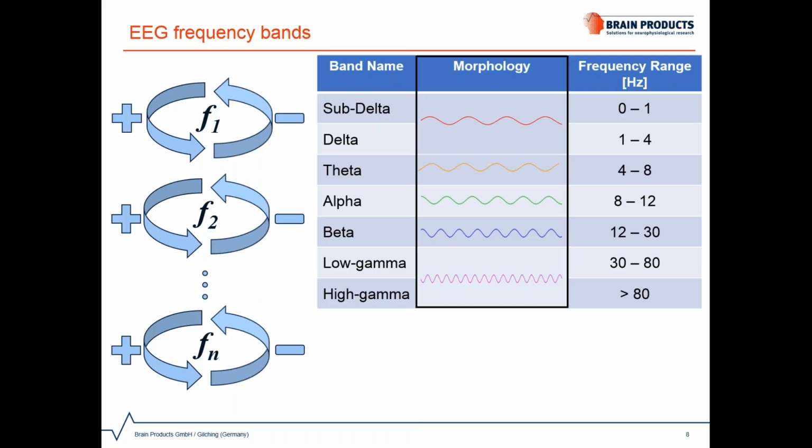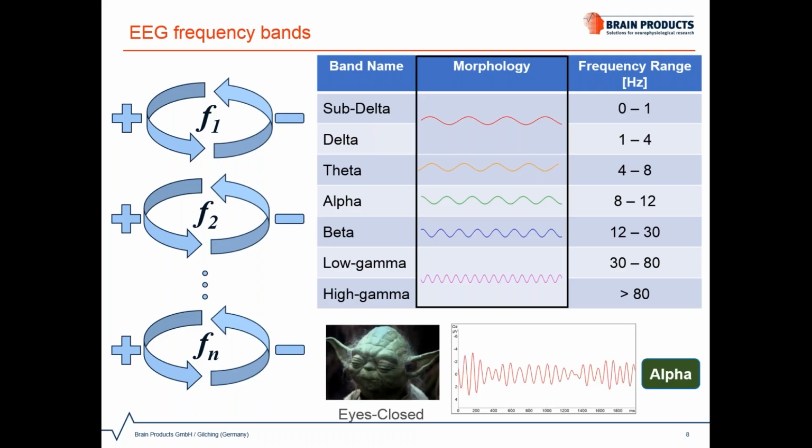These brainwaves differ in shape from one individual to another, depending on the functional status of the brain, such as when they are at the relaxed state, or attention, or sleep, or even some neural disorder. So the brain state of the individual makes certain frequencies more dominant. For example, the well-known experimental paradigm used to study spontaneous oscillatory activity is the state of eyes closed at rest. This brain state generates alpha waves, which is typically in the range of 8 to 12 Hz.